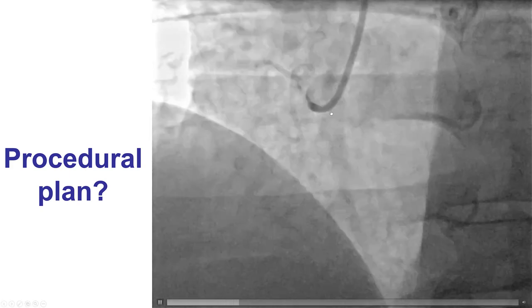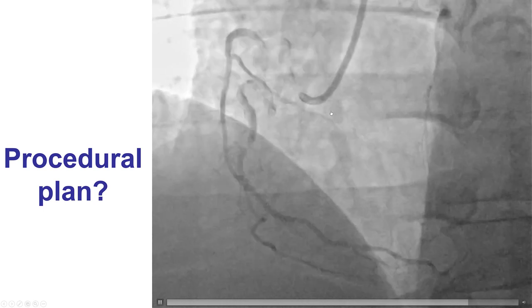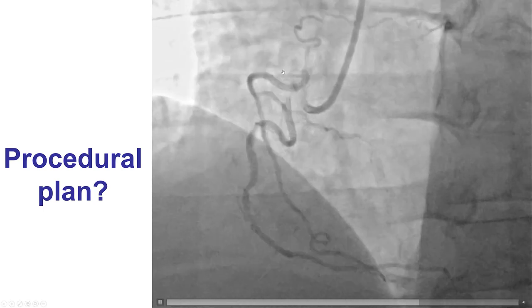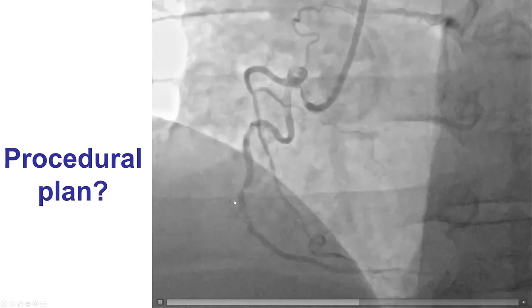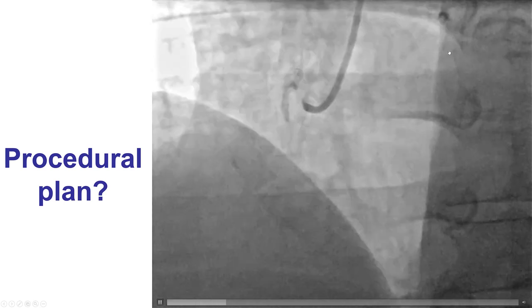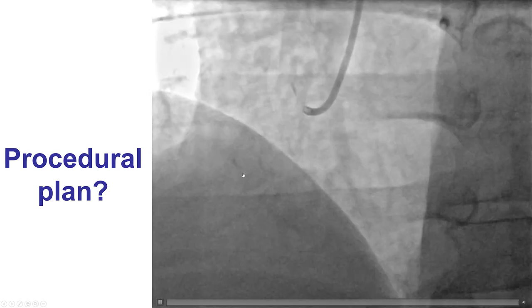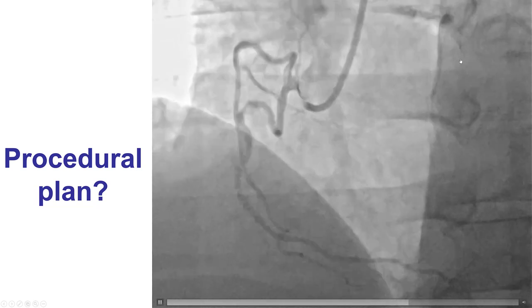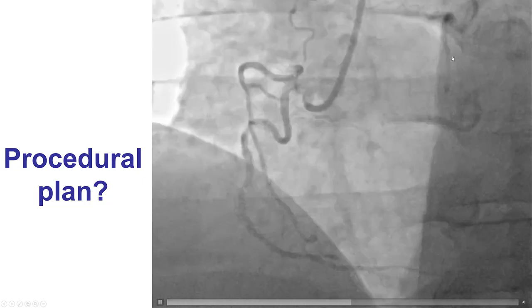Looking at this right coronary artery, it becomes immediately apparent that this is likely going to be a complex intervention, mainly because of the severe tortuosity of the right coronary artery, but also because the right coronary artery is supplying the left anterior descending artery, which is occluded. Therefore, compromising the flow in the right could have a significant impact on the perfusion of the LAD and potentially precipitate hemodynamic collapse.